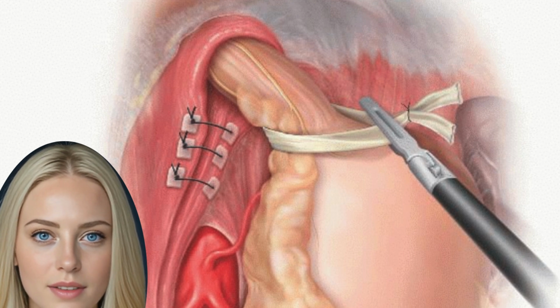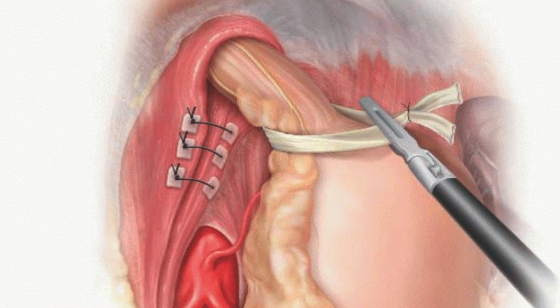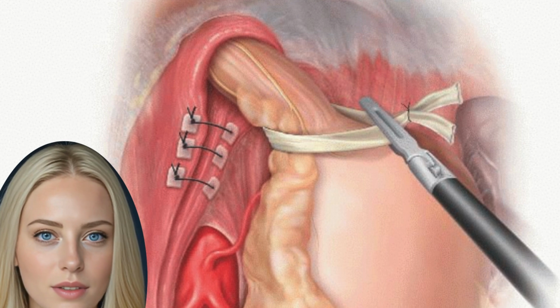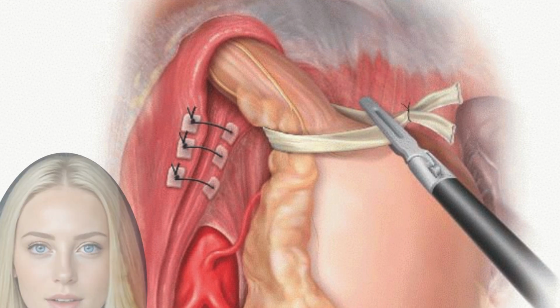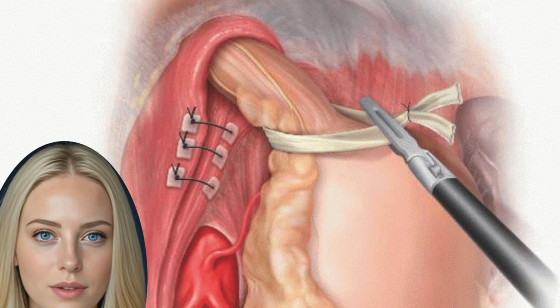Start on the left crus with traction on the hernia sac and use combinations of blunt dissection when near the esophageal body and ultrasonic dissection to remove the hernia sac when at a safer distance. Manipulation of tissues too far away from the esophagus may compromise the pleural cavity, and manipulation too close to the esophagus may incur thermal injury, often unrecognized at time of operation. Figure 14 demonstrates a close, but safe, distance of dissection to the esophagus.